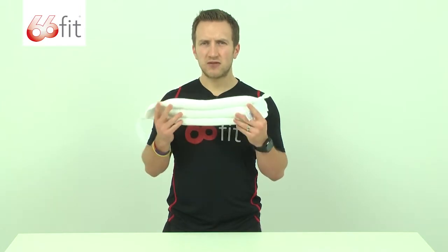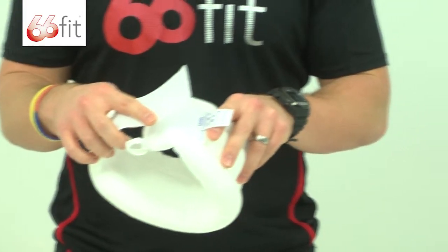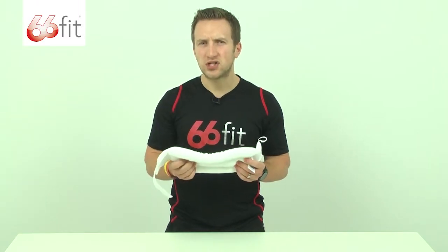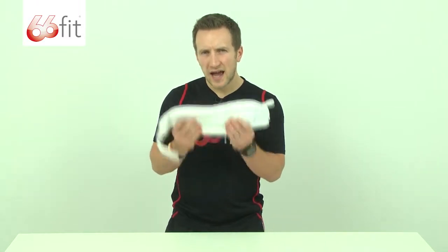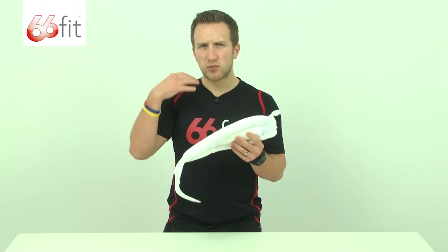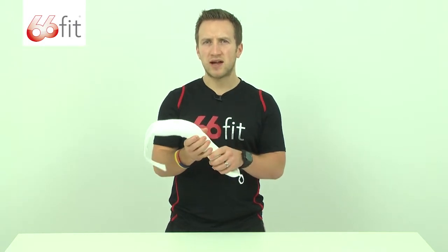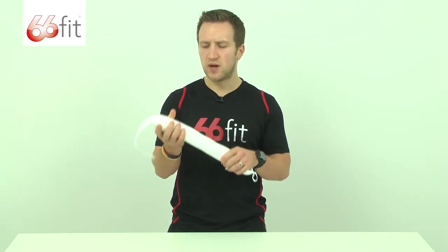To use the collar, place it around your neck and fasten the tabs in place. Now make sure that it's not too tight because you don't want it to choke you, but it needs to be adequately tight to provide enough support around your neck. The collar itself is actually designed to provide support to the muscles and the soft tissue around the neck following a minor injury such as whiplash.